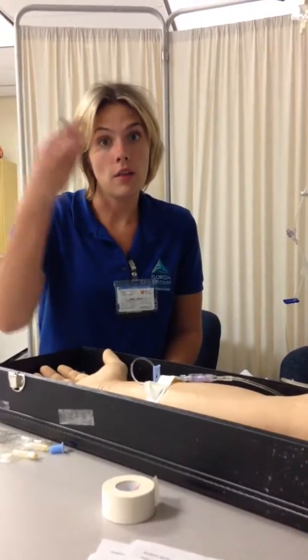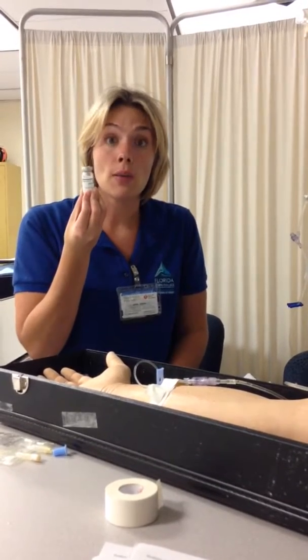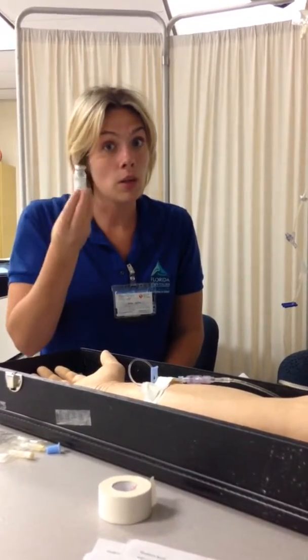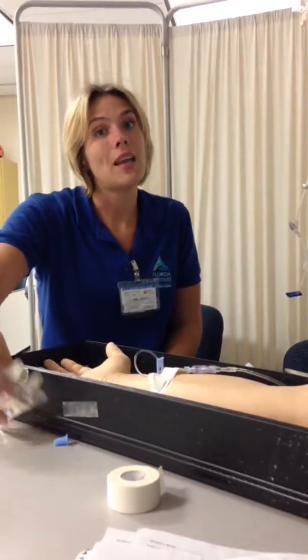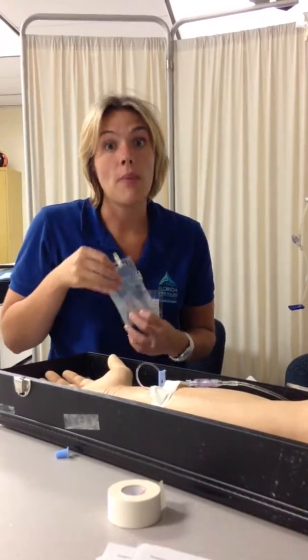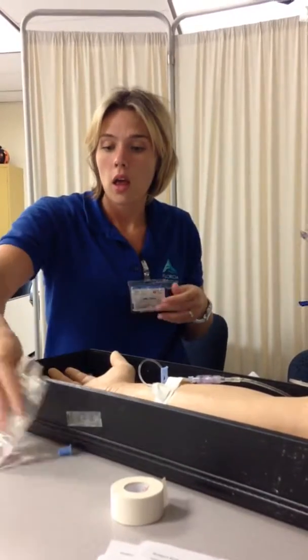I received a vial of Flagyl from the pharmacy, which states 250 milligrams per mL. So for my patient, I'm going to pull up 2 mLs, totaling 500 milligrams, and I'm going to inject that into a 100 mL bag that's going to be my piggyback, in addition to my patient's fluids that are already running.